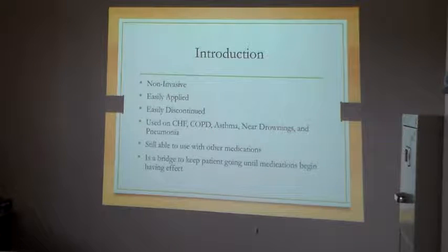And what this does is, this keeps the patient going until all the medications have their effect, and most importantly, this keeps the patient most of the time from having to be intubated. That's the biggest saving grace with this device is that patient doesn't have to have that tube put into their throat. That's what you want, is to keep them off of that.